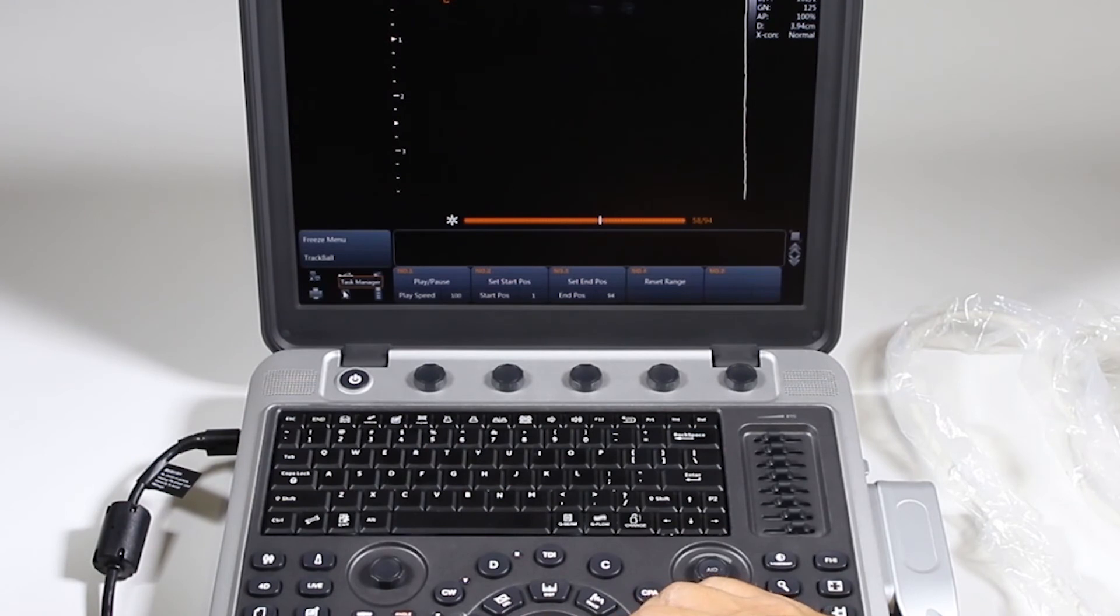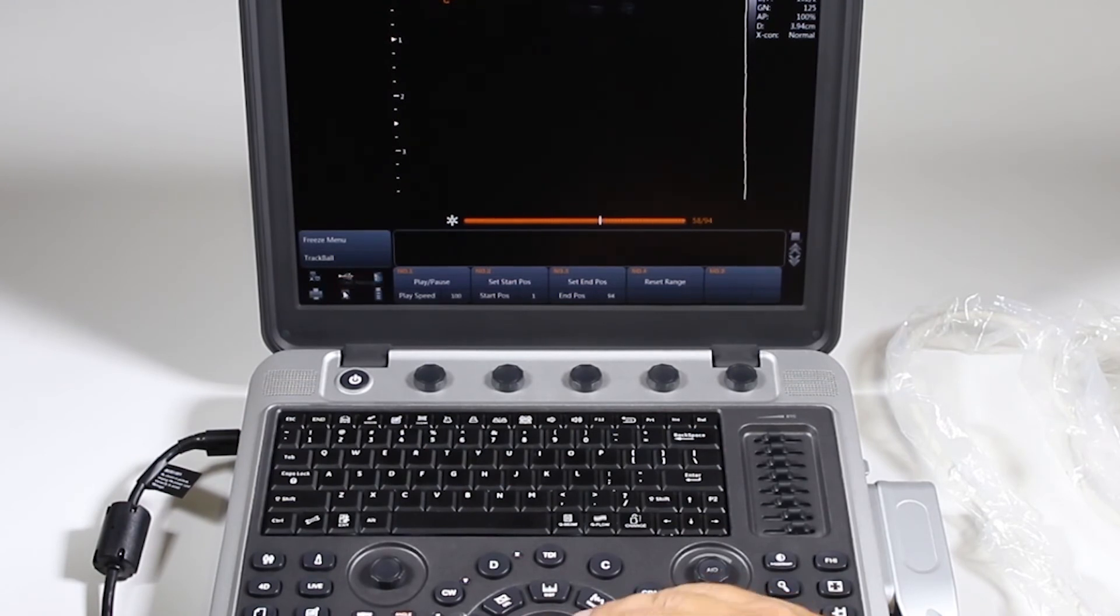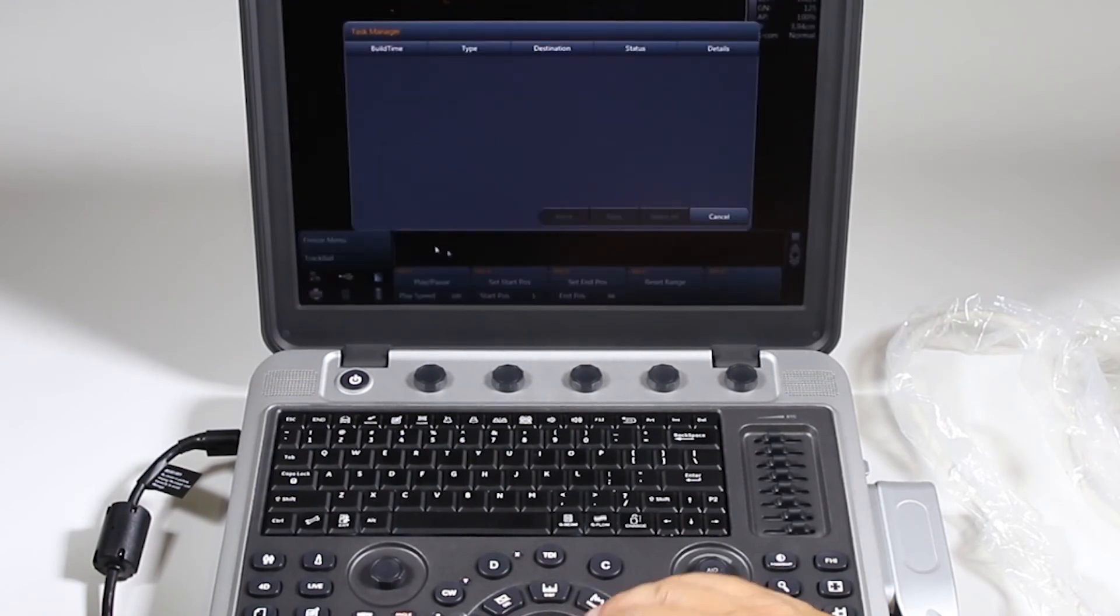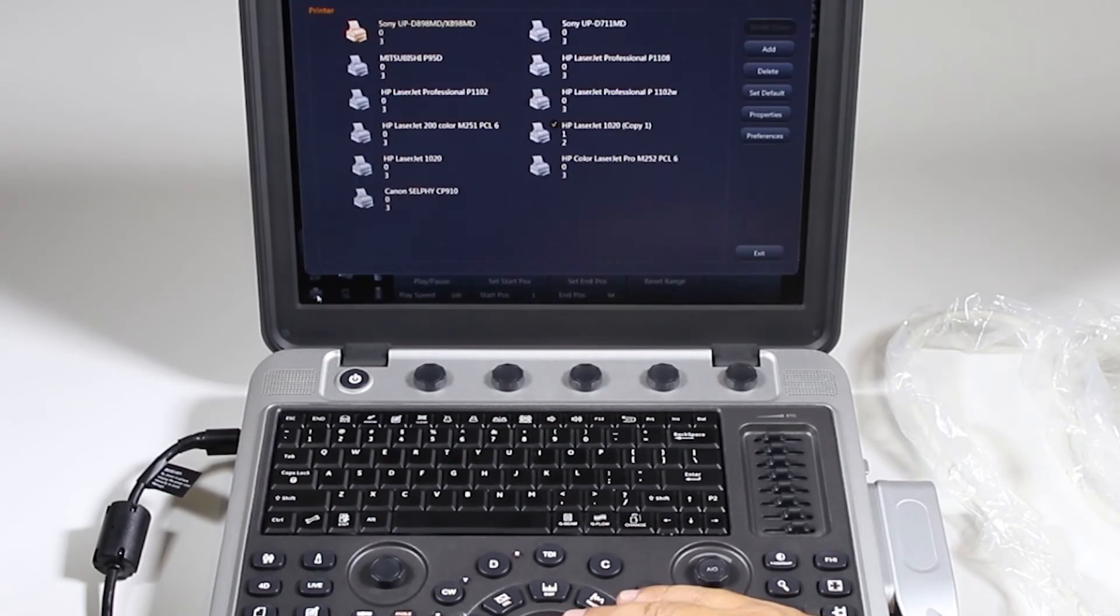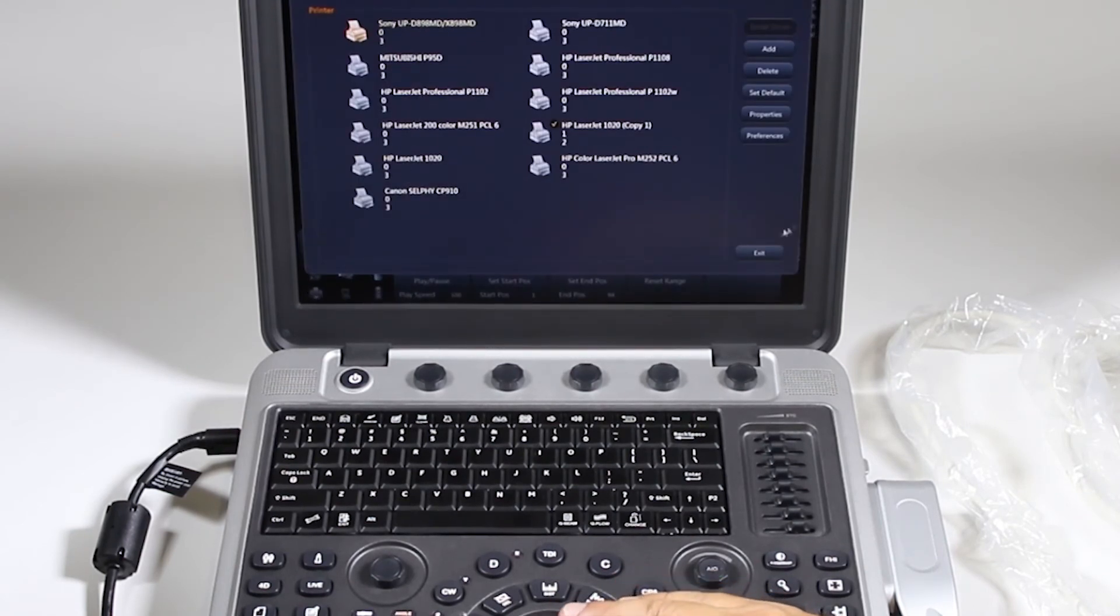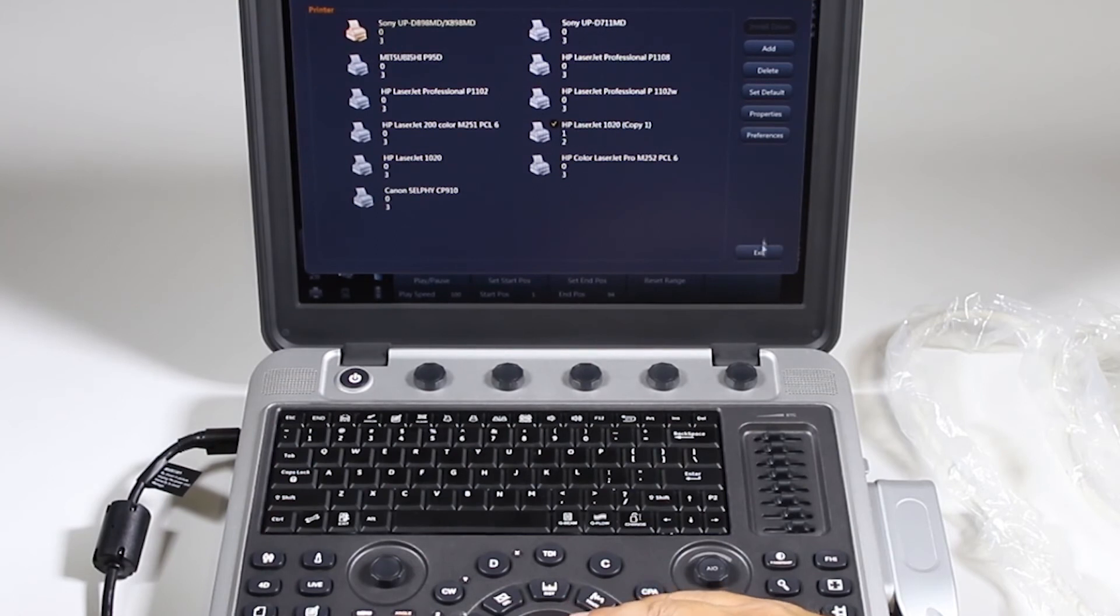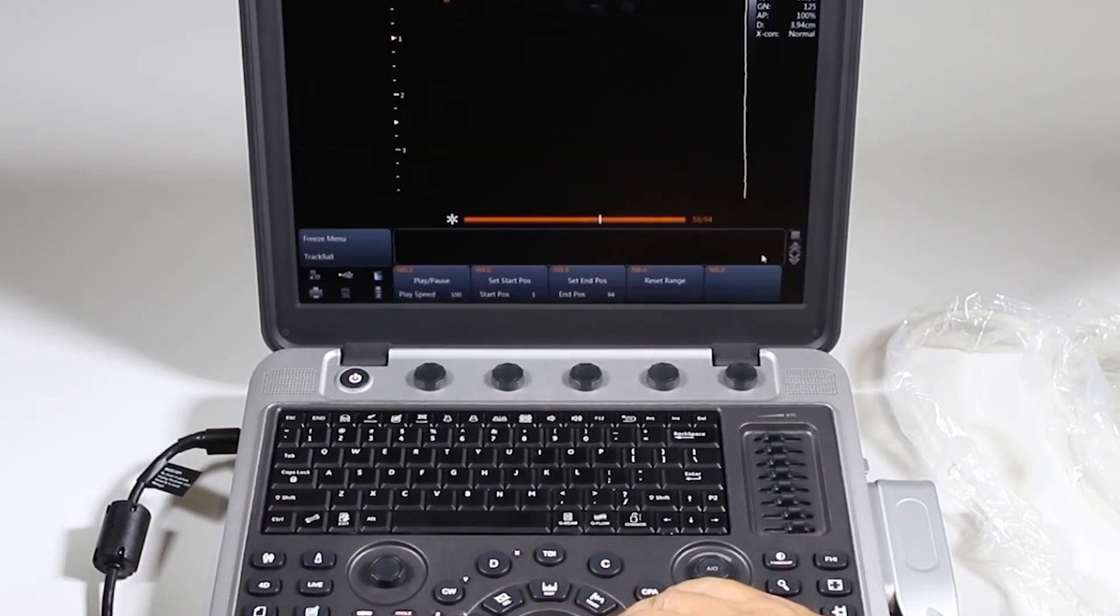Your task manager. This will show you your DICOM queue when you send something in DICOM if you're a part of that. And here you can click on your printer setup and choose your default printers, add or delete printers, etc.